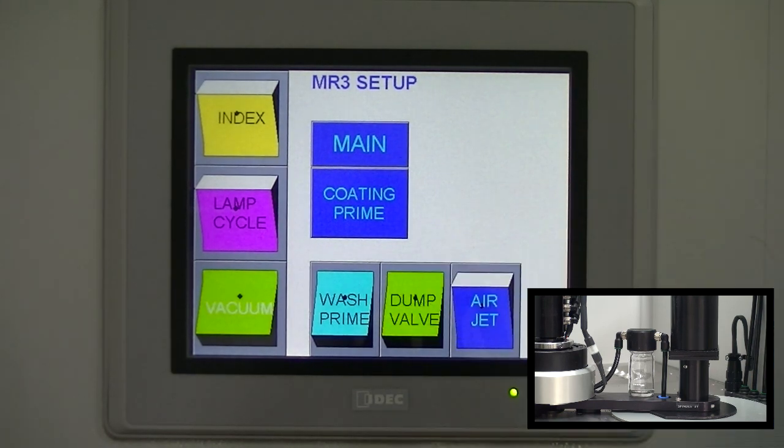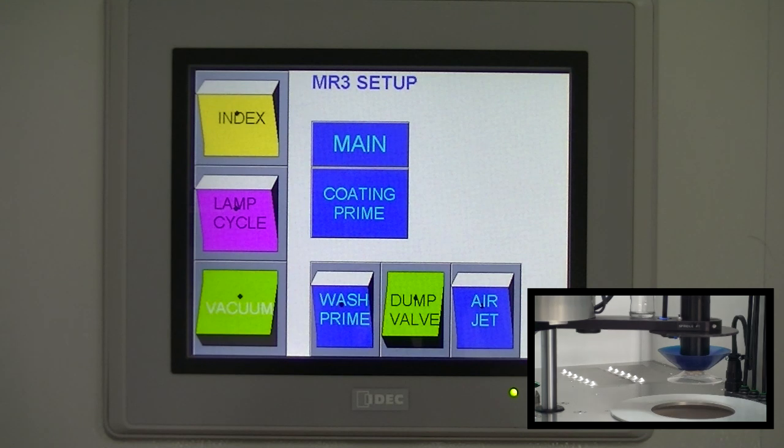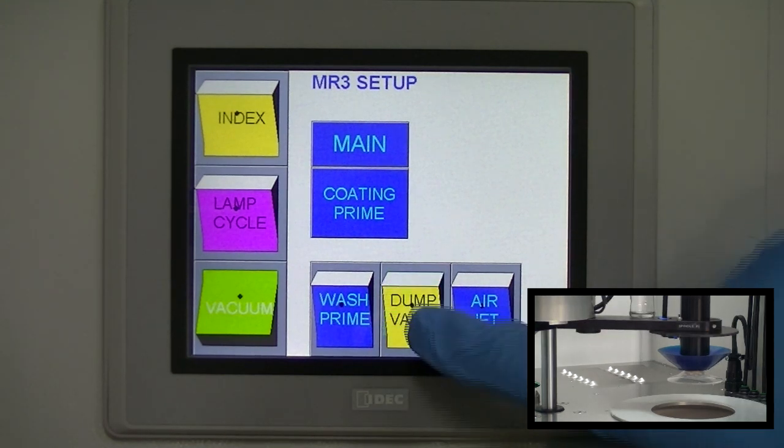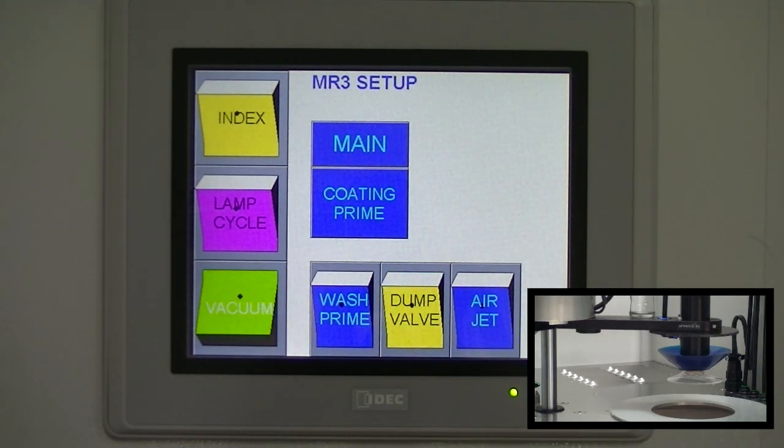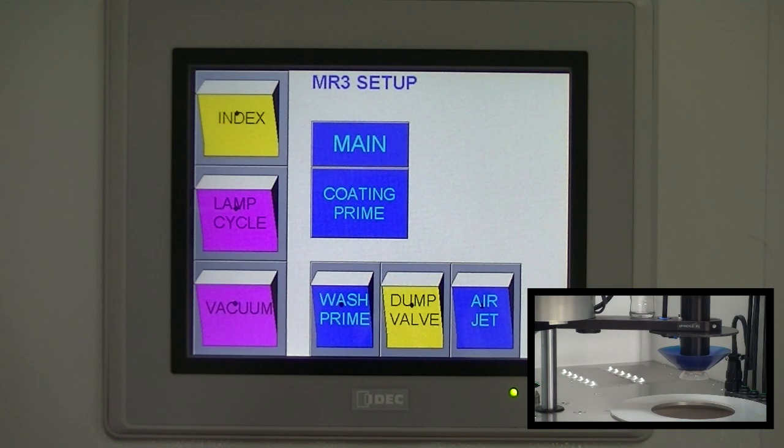Press dump valve button to open and purge pressure. Press wash prime button to raise lens out of bowl. Press dump valve button to close dump valve. Hold onto the lens and press vacuum button to remove lens.